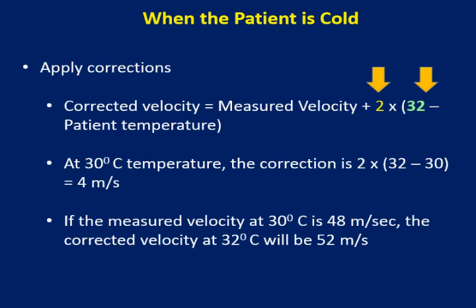This is not my preference for 2 reasons. The correction factor varies among different individuals. Secondly, the factors are based on healthy nerves and may not be suitable for nerves affected by disease.